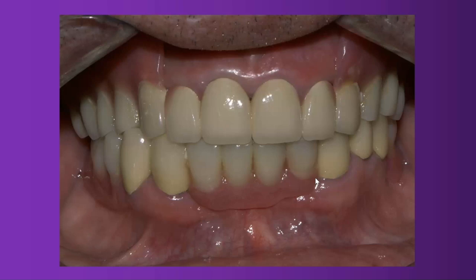Obviously, in the end, we had to change everything. You see a little bit of pink aesthetic there, or the pink ceramic, just to make it look better. Otherwise, it's not easy to make it look nice. But anyhow, it's way nicer than clasps on the surface of the teeth.